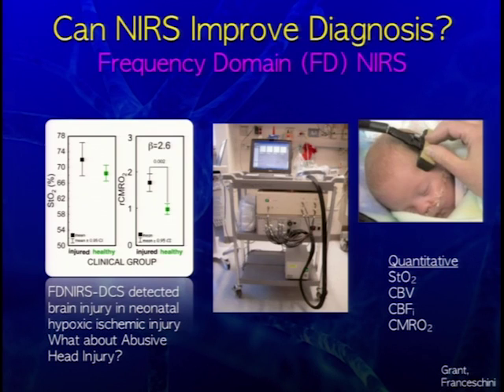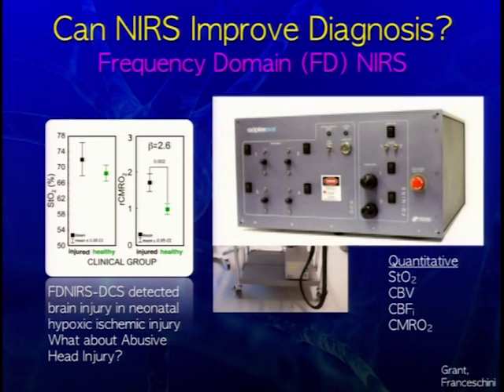And we can pick that up at the bedside with these little monitors put on the bed. The actual system that gives you the blood flow is just one of these. That's this system here called the diffuse correlation spectroscopy system. So even just this system in the emergency room may be helpful as a supplement to screen infants to see if there's any evidence of abnormal cerebral blood flow. Again, we need to get first more normative measures so we can have standard norm values and then to screen for concern for areas of increased blood flow.